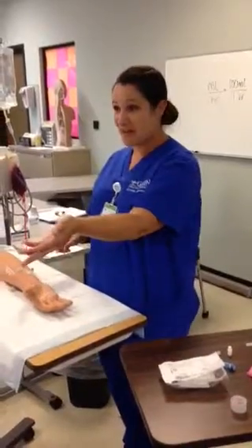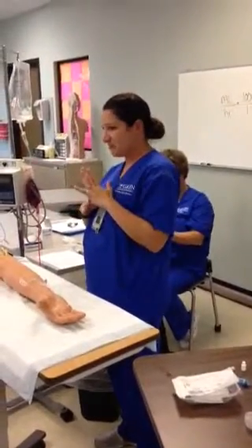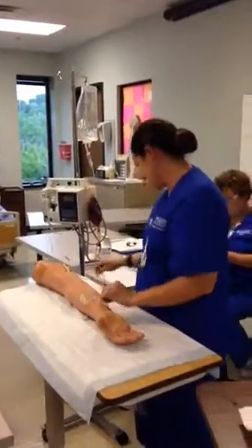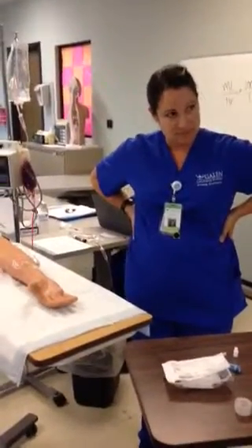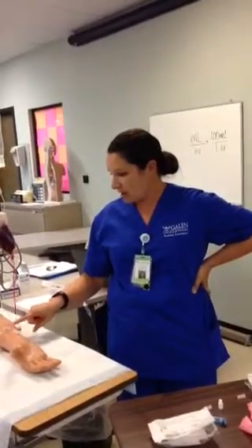I'm talking to my examiner now, who says, so now I'm me, not you. Because now the person that's me is gonna do this. We don't have to tape the actual IV cannula for the CPE. You know what I'm talking about? Where the IV's in, that's what the Tegaderm's for. You cannot have tape underneath, I'm talking about over top of it, to reinforce it. You don't need to. You need to secure the pigtail just like I have here.